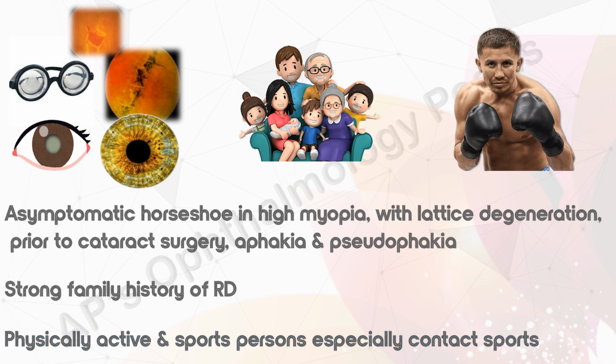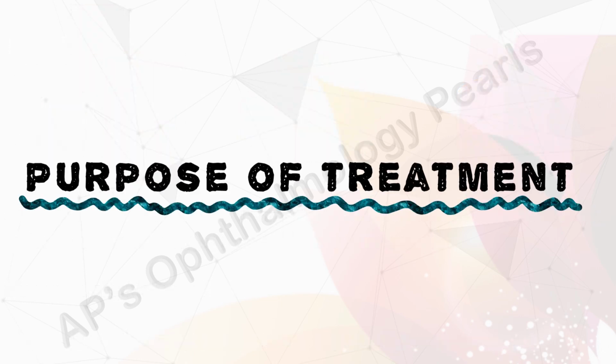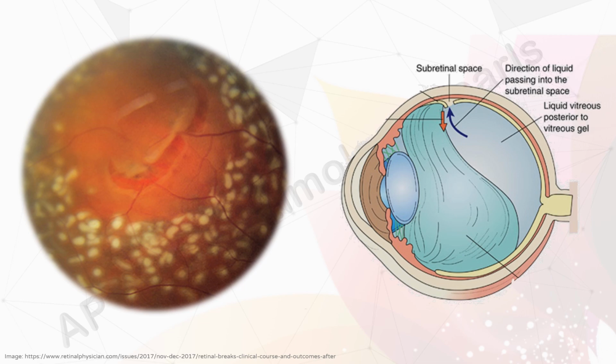Some evidence suggests prophylactic treatment of asymptomatic retinal tears be considered prior to YAG laser posterior capsulotomy in high-risk eyes with axial myopia. The purpose of laser treatment is to create firm chorioretinal adhesions around the break in order to prevent access of fluid vitreous to the subretinal space, thus preventing a neurosensory detachment.